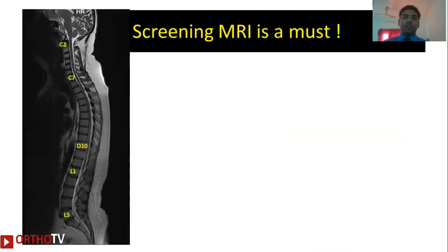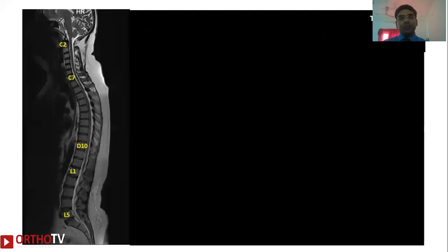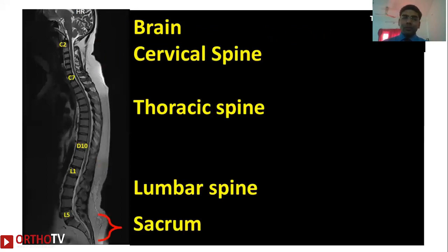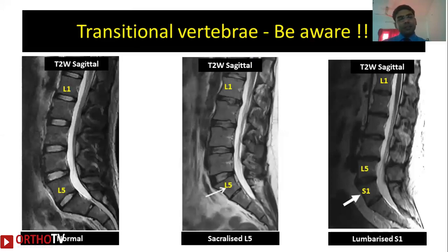The first MRI film we should see is a screening MRI, and one should make a habit of ordering a screening MRI whenever ordering an MRI of a particular region — this will prevent missing any pathologies above or below the region of interest. On a screening MRI, which is a T2-weighted sagittal image, you can see the lower portion of the brain, cervical spine, thoracic spine, and lumbar spine. Two points to note: counting is always done from the top in an MRI, and the spinal cord usually ends at the lower border of L1.